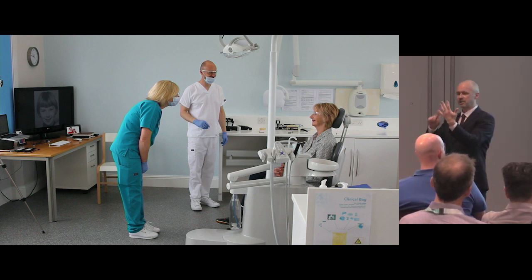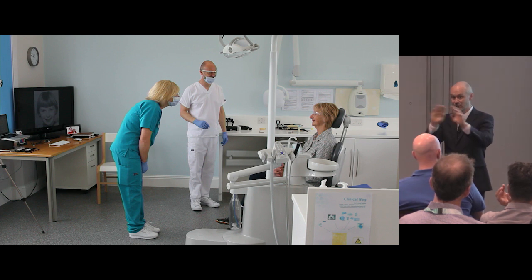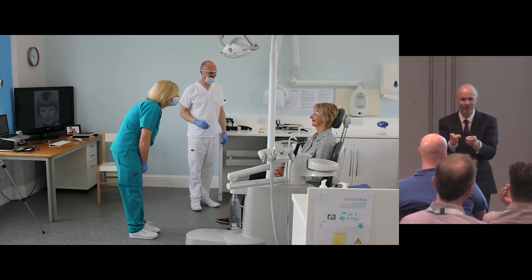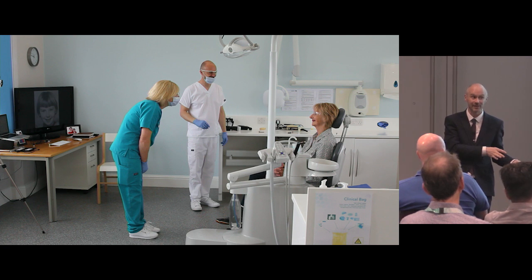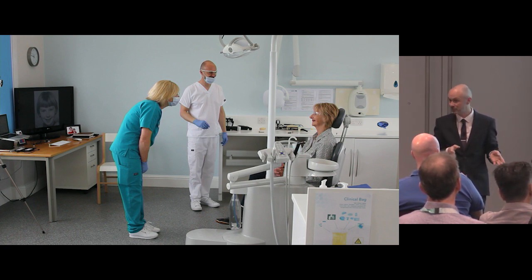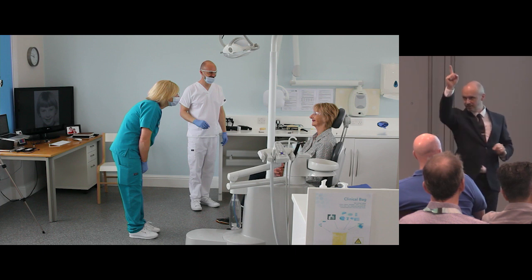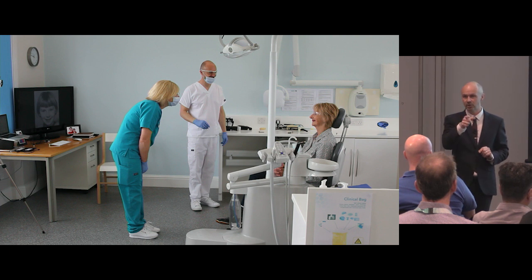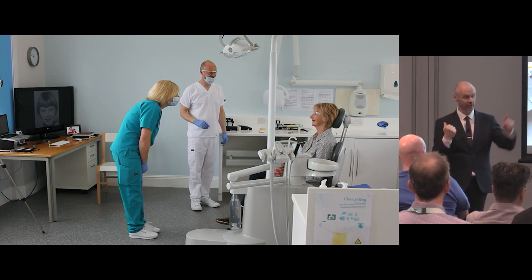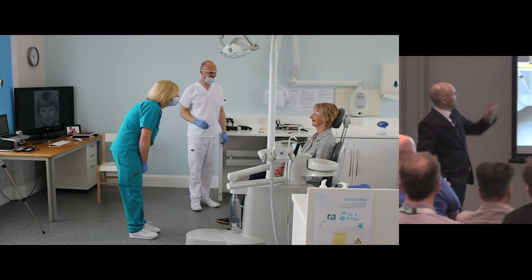So it's those 5 things: lip support, incisal plane, occlusal plane, buccal corridor. Trim that according to the dentate picture. If the patient wants a similar dentition to how they used to be, fine. If they want wall-to-wall Simon Cowell, big American smile type thing, then we just leave the buccal corridors there. Simple. And then fifth, centre line, carve that on. I don't bother about smile line or carving that on, because I do a 2-size calculation, which I'll show you later in the partial denture section, how to calculate the correct size of tooth. It's a really neat little formula. So, there we've got Julie.